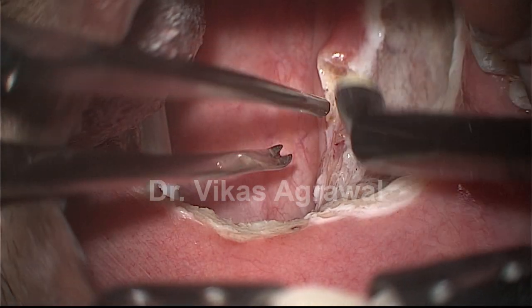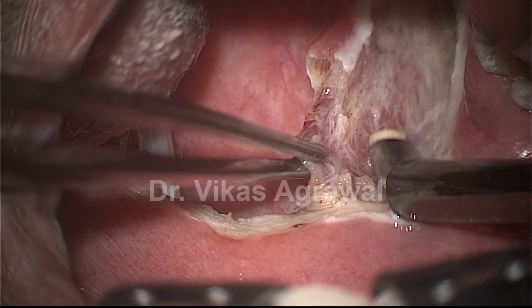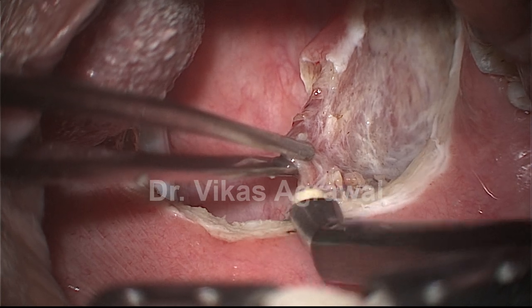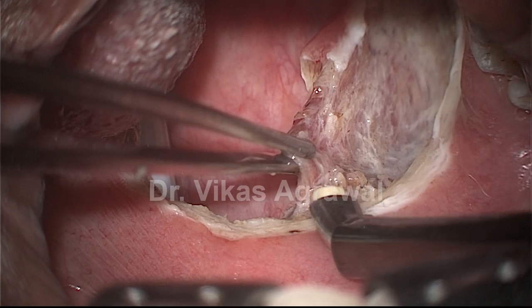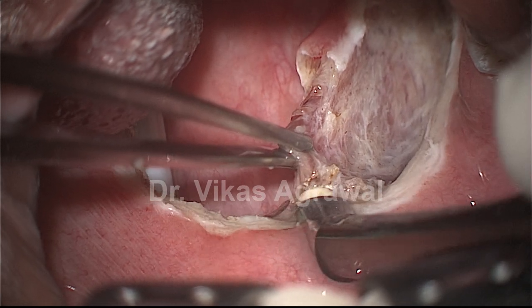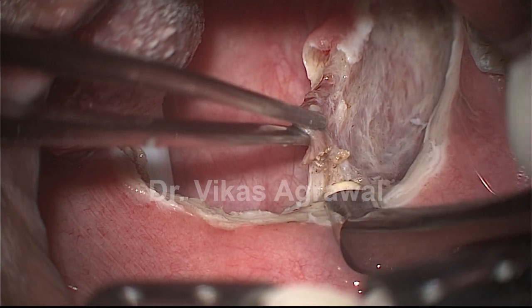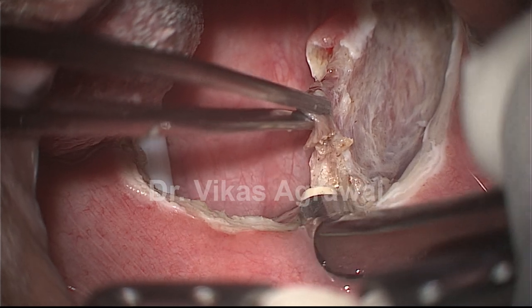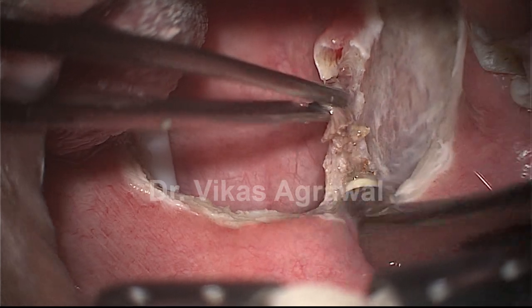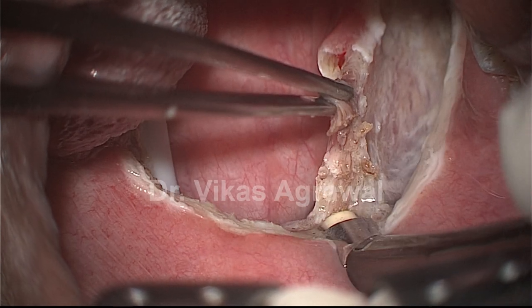You can already see how much of space is created. What is most important is that this posterior pillar, or the palatopharyngeus, which forms the anterior wall will be transposed to the lateral wall. So this anterior wall will be transposed to the lateral wall.